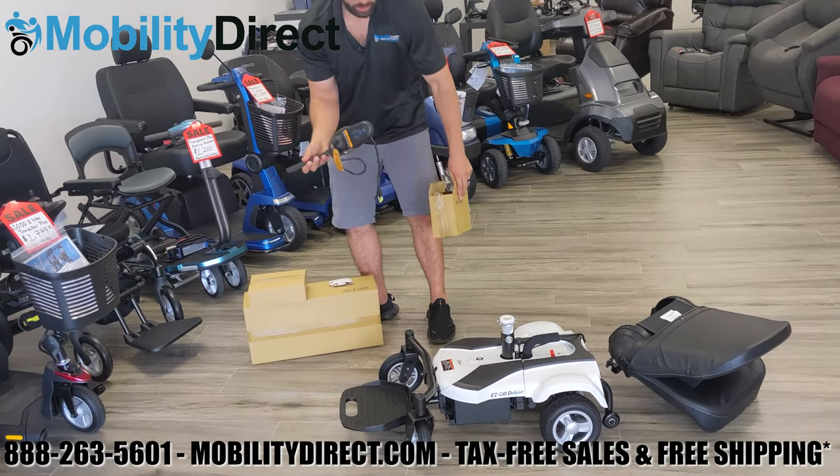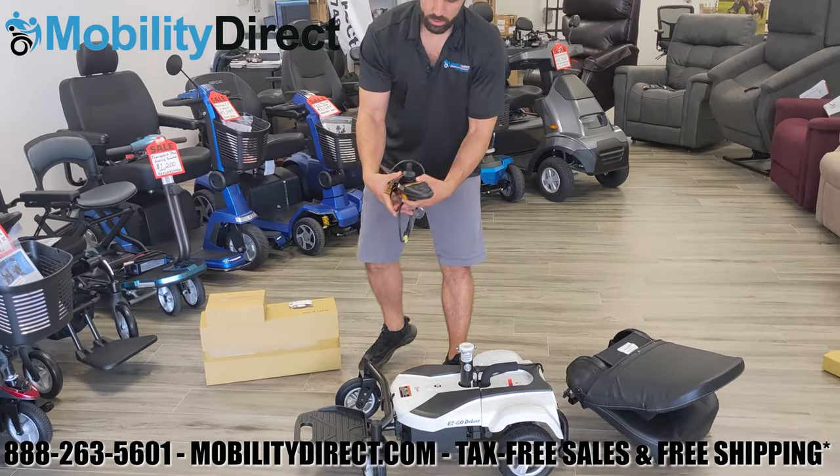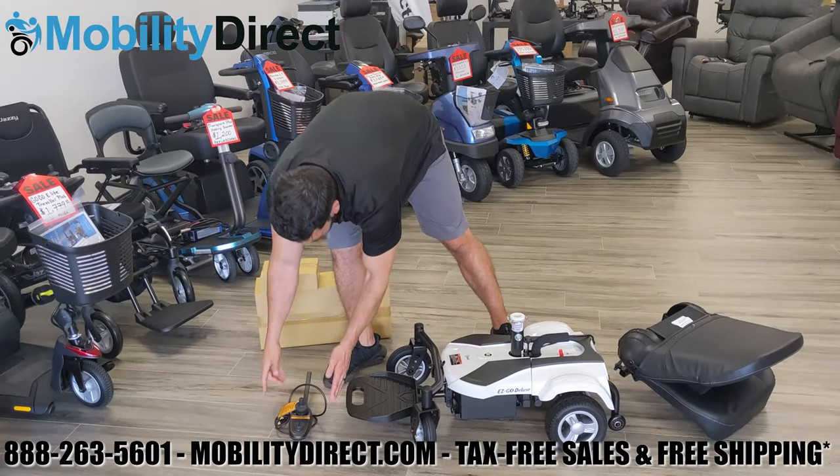Next, we're grabbing the joystick and unboxing it carefully. The joystick is delicate — be very careful with it as you don't want to damage it.